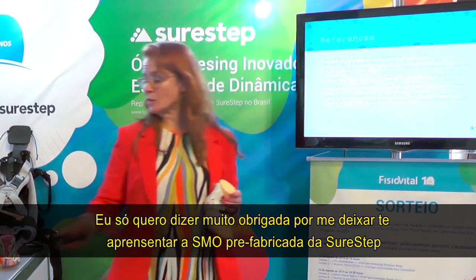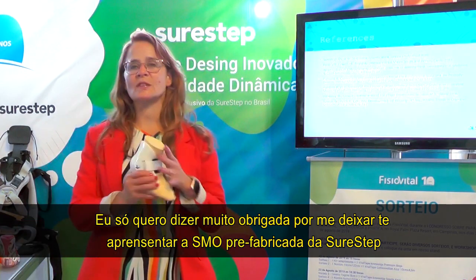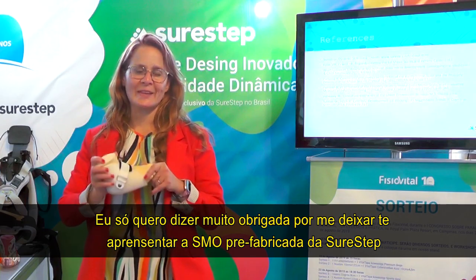Thank you so much for letting me introduce our SureStep prefabricated SMO to you today.